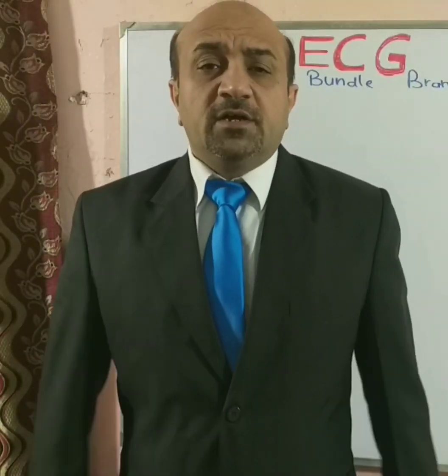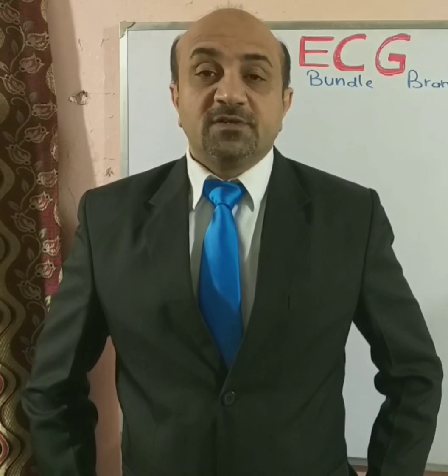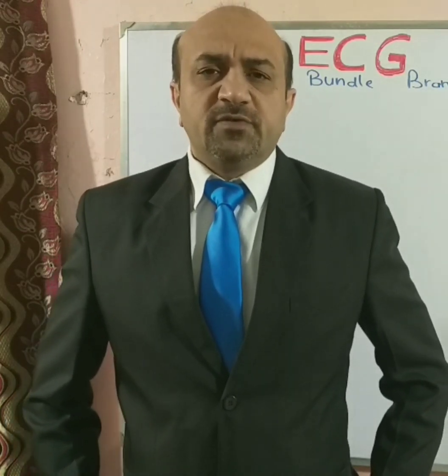Hello everyone. In this video we will talk about the left bundle branch block, which is obviously the second video in terms of the bundle branch blocks.